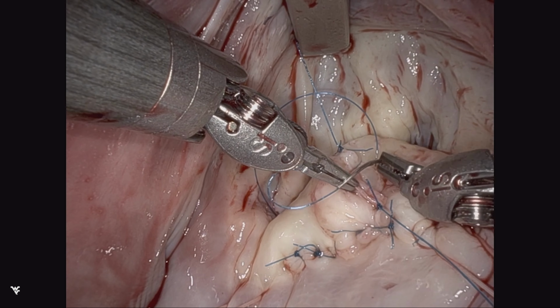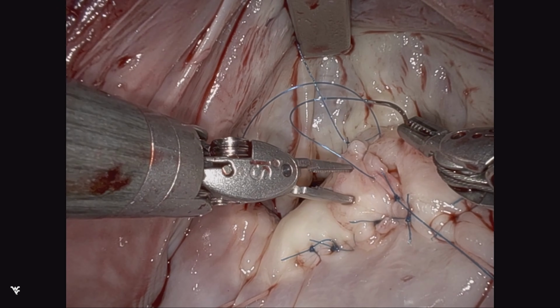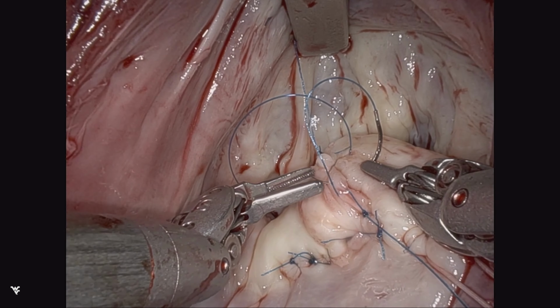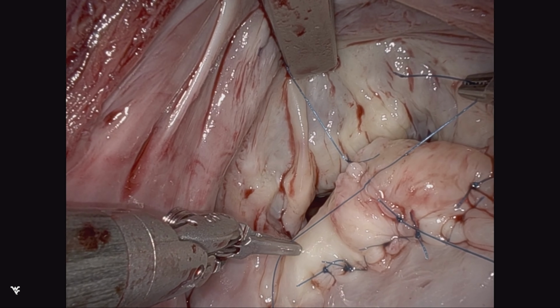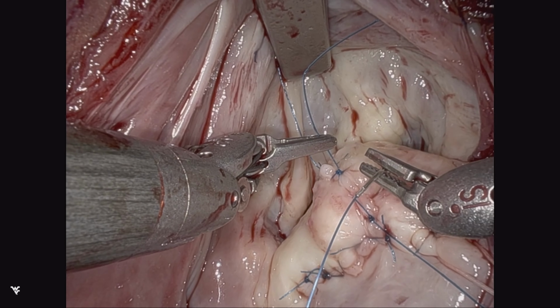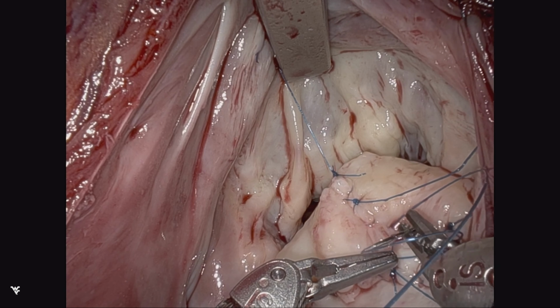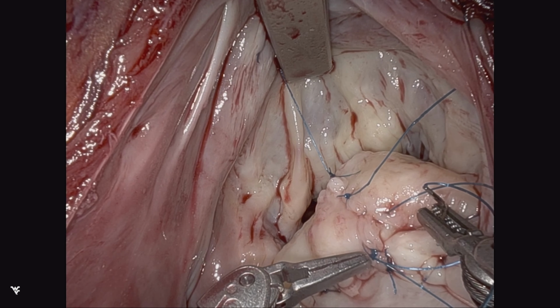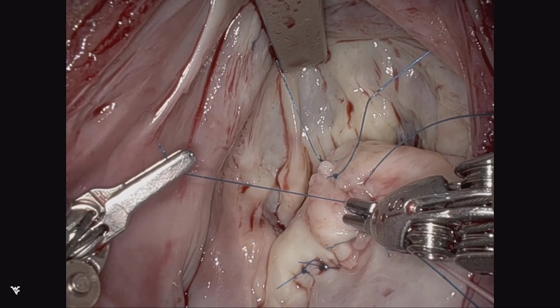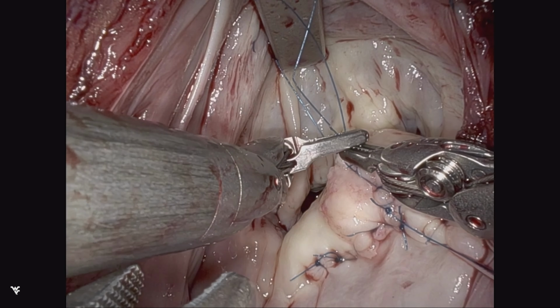Again, leaflet tissue to leaflet tissue aligned and not a bulky type of anastomosis is important for a smooth coaptation surface. Once again, demonstrating dividing one limb of the previous stitch, keeping the other limb to allow it to stretch, and then removing all excess suture material, which is very easy to do with the robot.